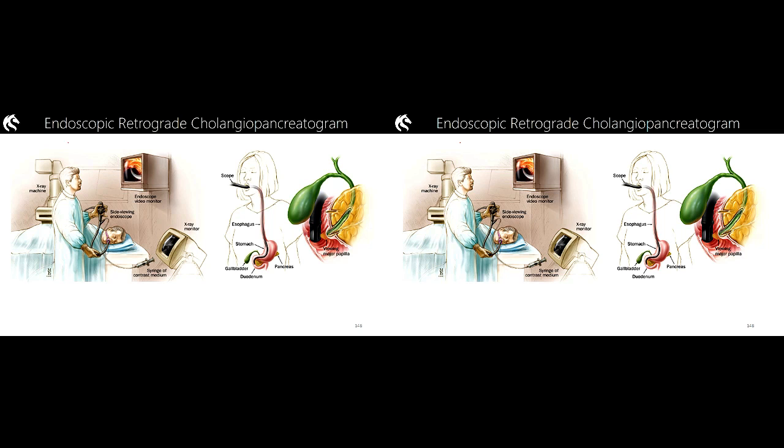In the diagram in front of you, you can see that this patient is lying prone with their right side raised. It's a fluoroscopic examination, and so the right posterior part is closest to the image receptor, making this an RPO projection. Hopefully that will make sense to you.